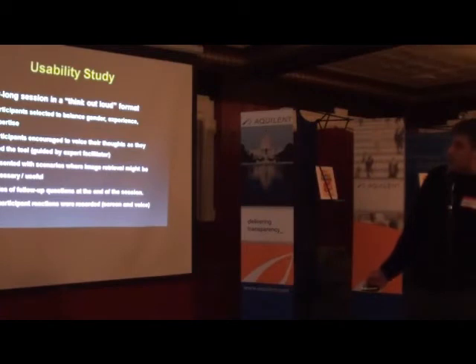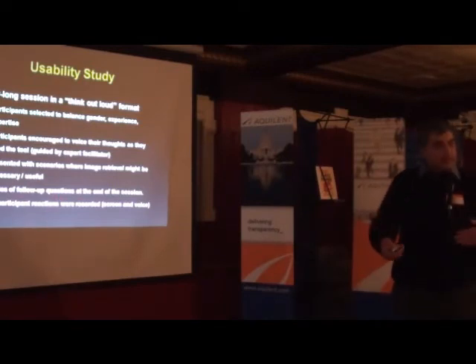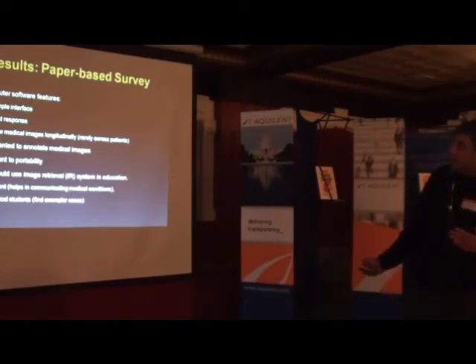And we also had a real study where people used our tool. It was an hour-long session. We had them think out loud what they thought about the tool, and we were encouraging them to voice their thoughts. And we had follow-up questions before and after that were compared against what they had opinions about this idea of finding similar imaging, finding similar patients before the fact. The idea was, well, a large percentage wanted to mark the images, and they want to be able to take them from one healthcare center to another, and they would use image retrieval if they could in education and research and clinical care.